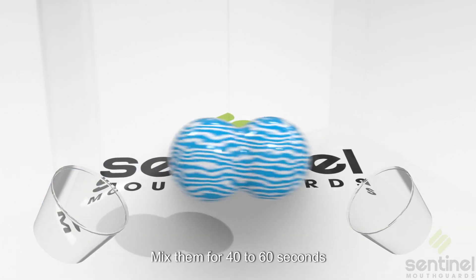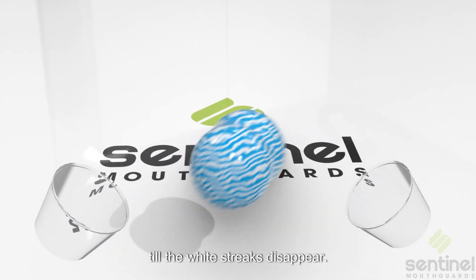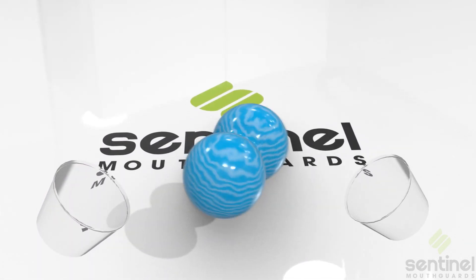Mix them for 40 to 60 seconds, till the white streaks disappear.